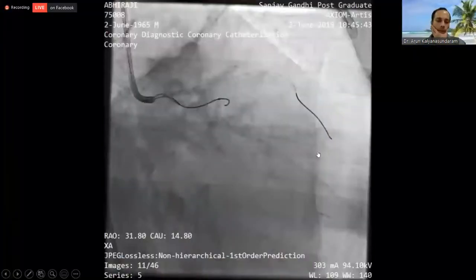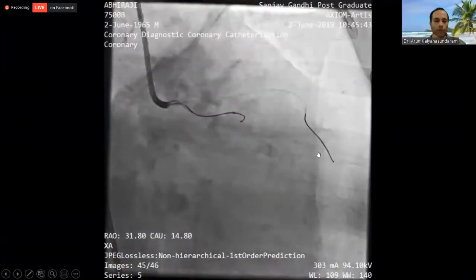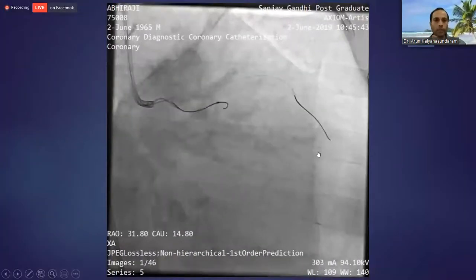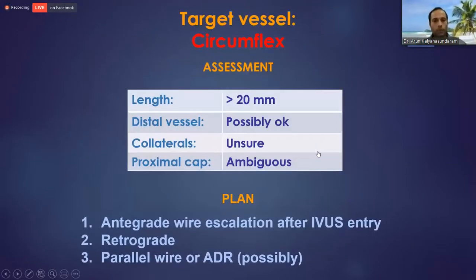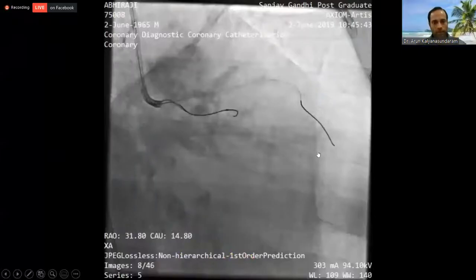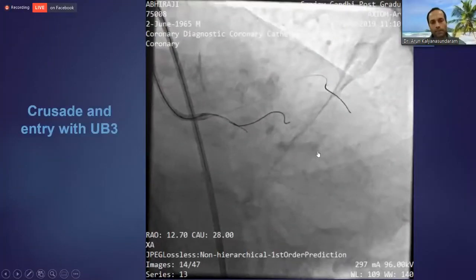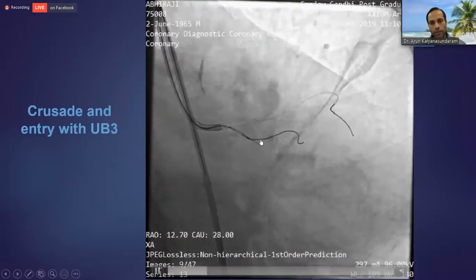This was again another live case that I scrubbed with one of the experts from Japan. I'm just going to go back to show you what this vessel is about. So we identified the proximal cap. Got in. It's a circ CTO.